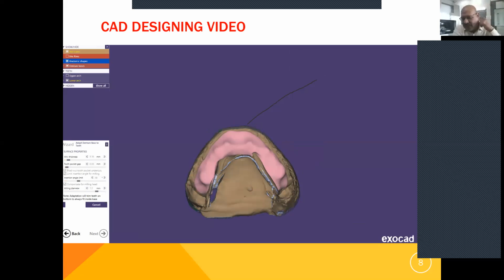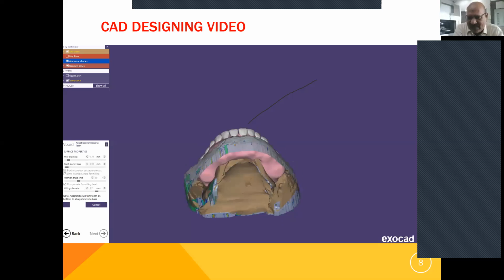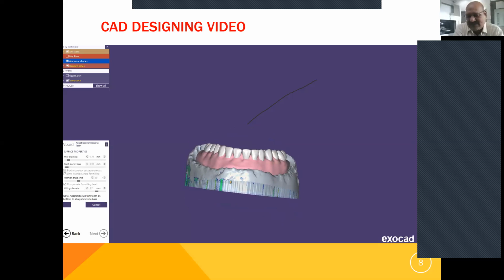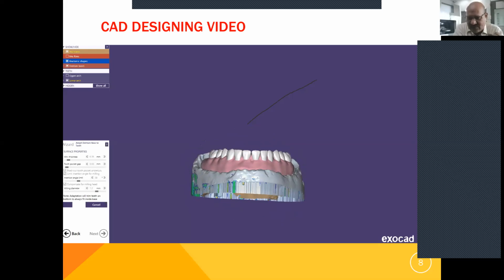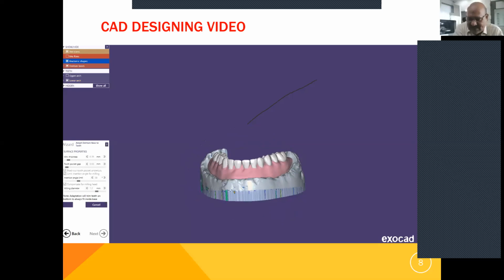Okay. So when we mill the denture, firstly it is free from any unpolymerized content, because conventionally the polymerization is often not complete, and that is irritating to the soft tissues. So from a fixed, hard, solid blank we mill, so we ensure that polymerization is not an issue, and it doesn't hurt the tissue in any way, the monomer liquid kind of thing. So that is also a big advantage. Fit is a great advantage.